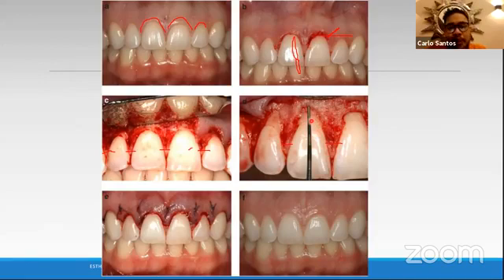Okay, so 2 millimeters from there, you reduce bone. Remember, gingiva, where the bone goes, the tissue will follow. So it's just as simple as that. If you reduce that, if you thin that out, of course, the gingiva will follow. The tissue will follow whatever bone you reduce.